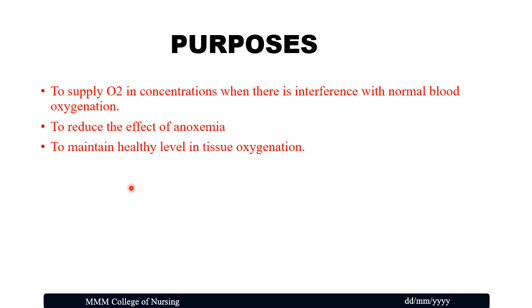Purposes: to supply oxygen in concentrations where there is interference with normal blood oxygenation, to reduce the effect of anoxemia, and to maintain a healthy level of tissue oxygenation.